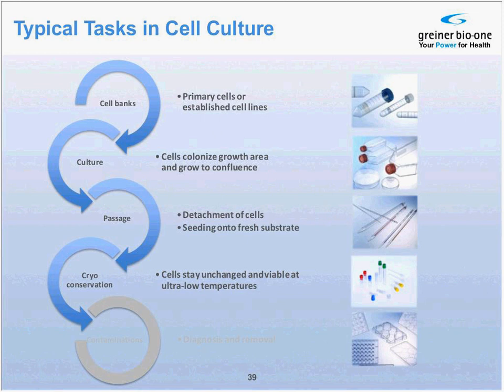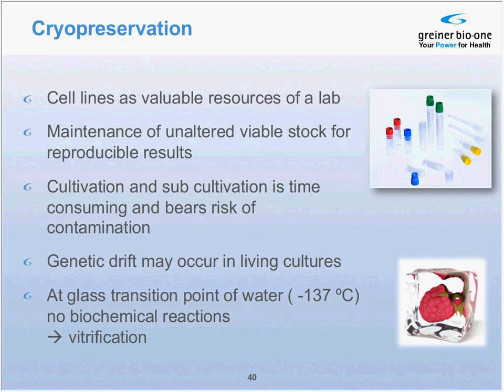Having covered the relevant aspects of obtaining cells, culturing cells, and detachment of cells, it's time to have a look now at some backup strategies for cells. The cells are oftentimes required only for certain aspects of a project or experiment. It makes sense to freeze cells regularly.